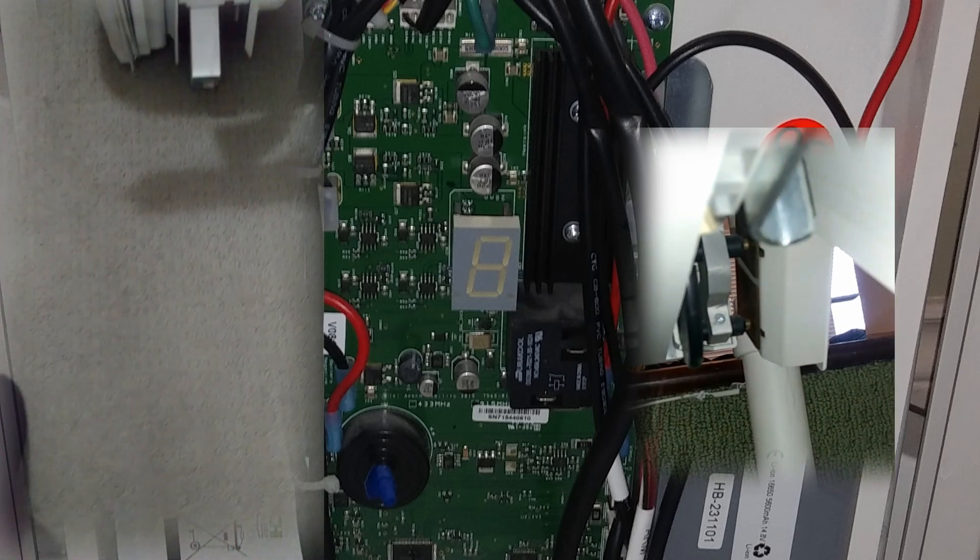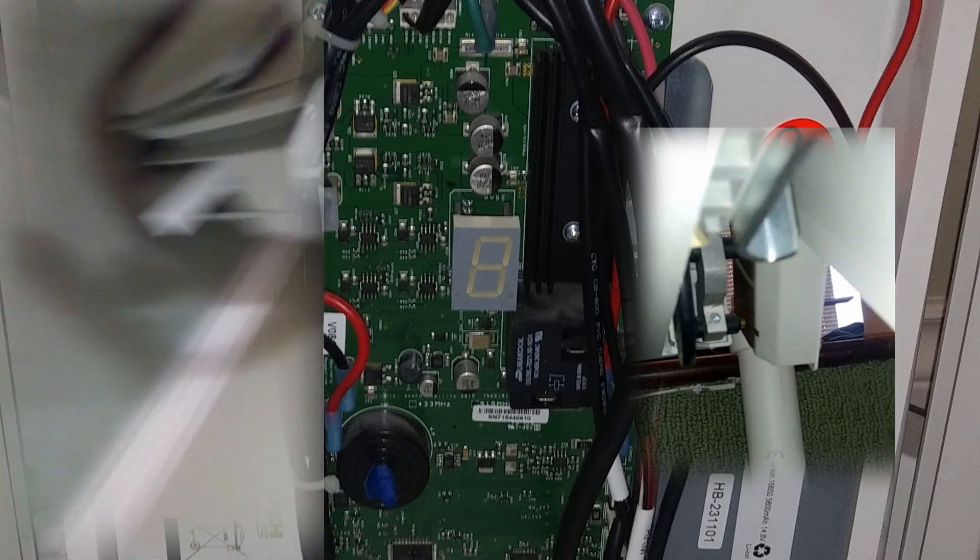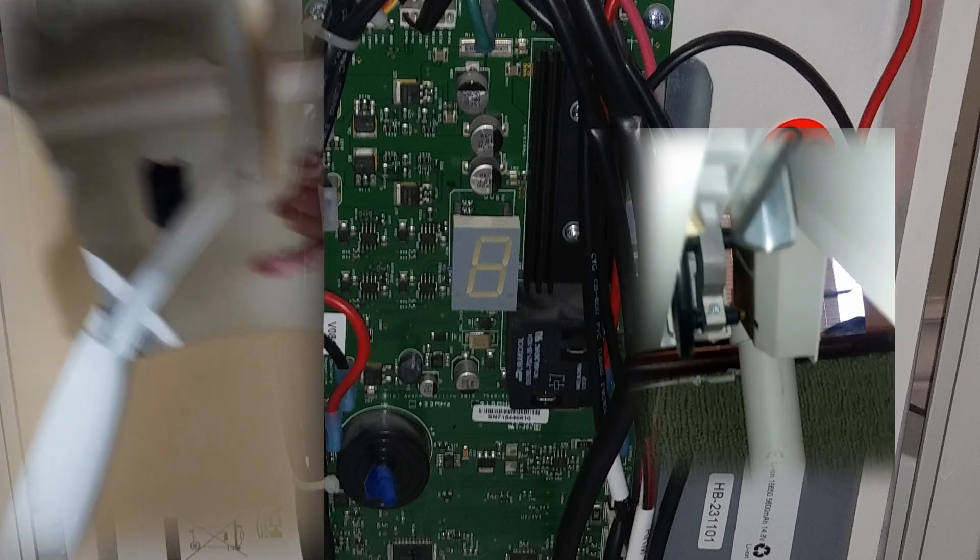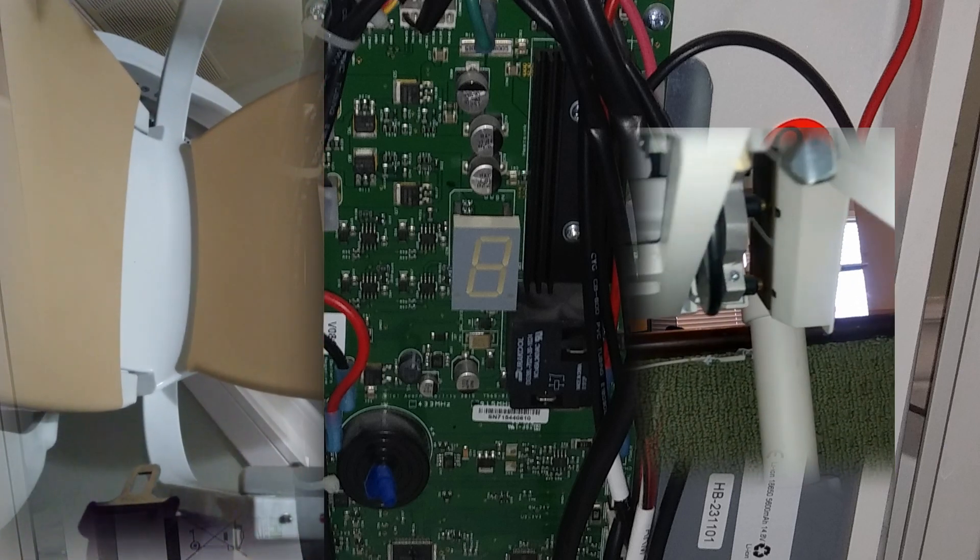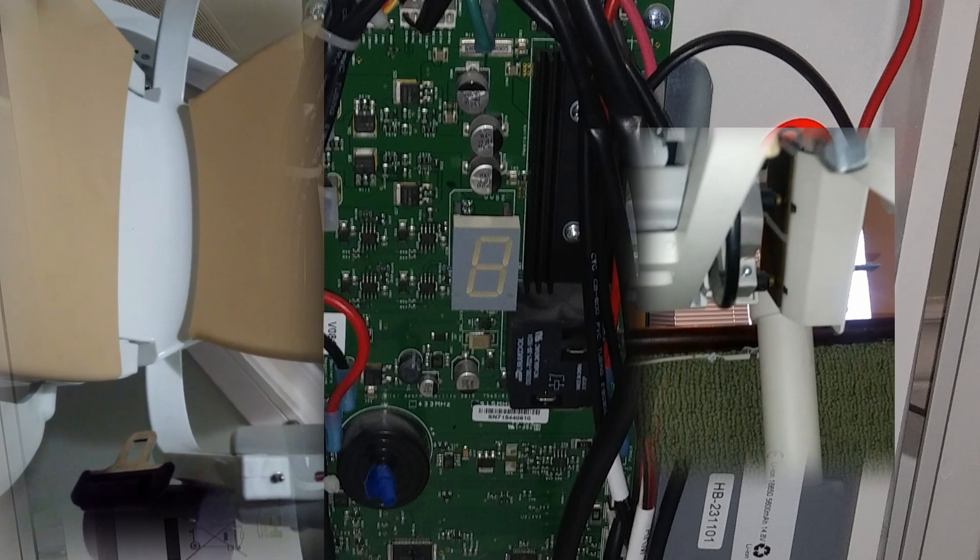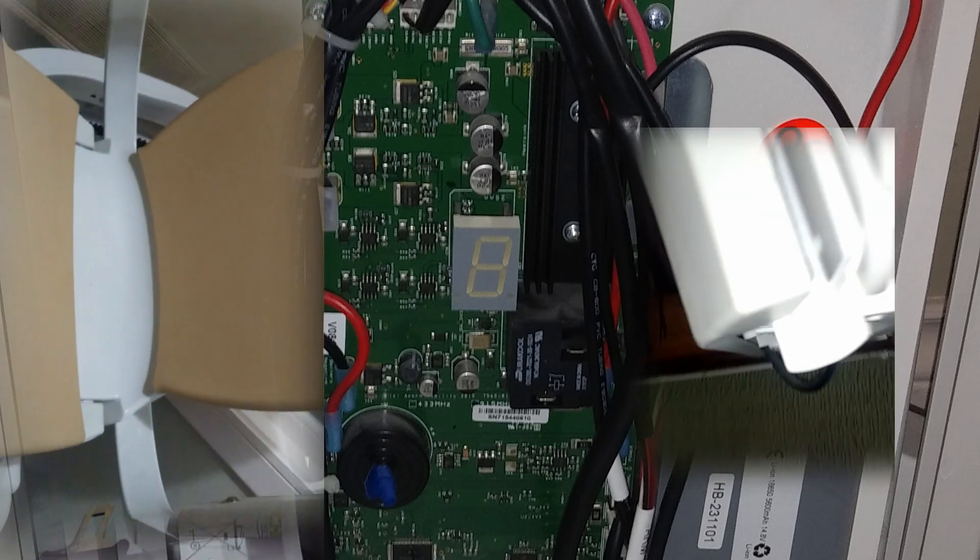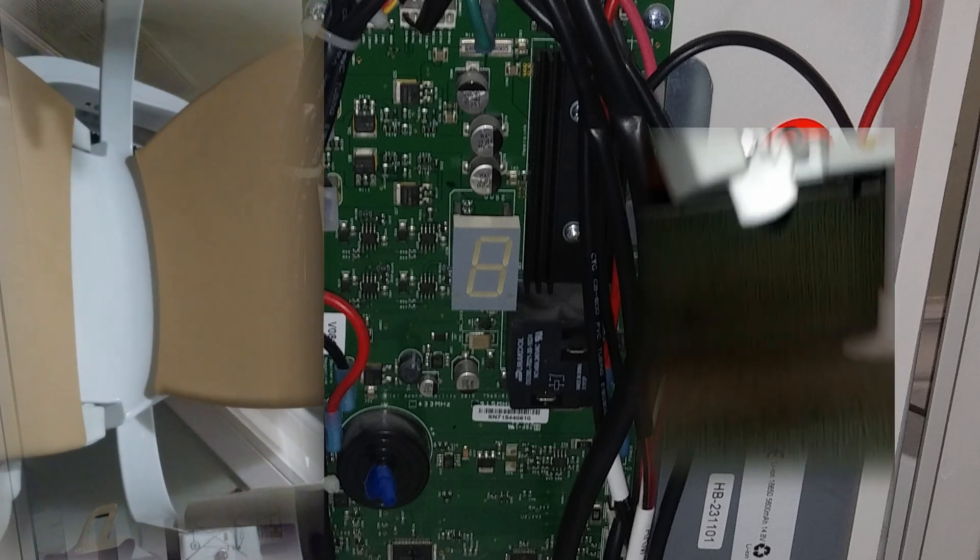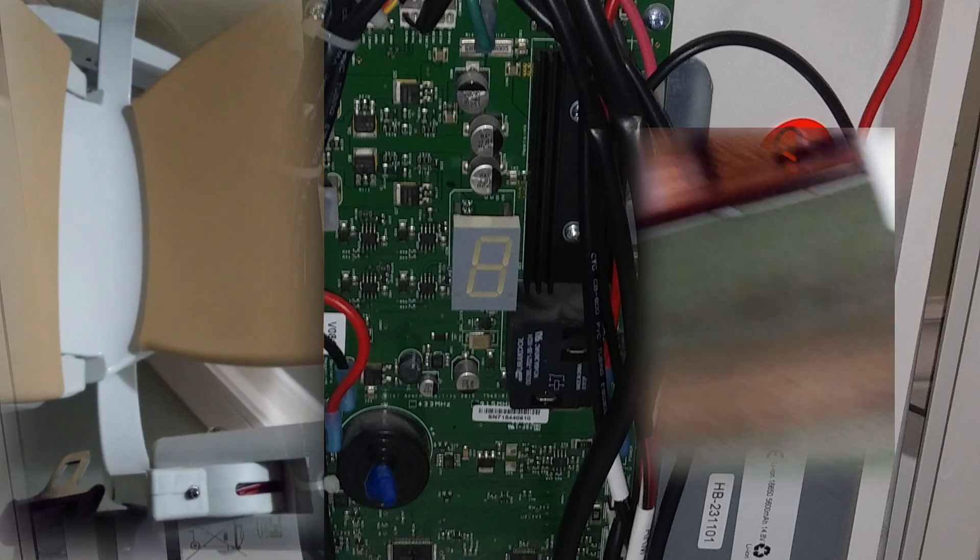In this video that you're watching, I'm showing you the steps involved in reprogramming the sixth version of the Acorn 180.